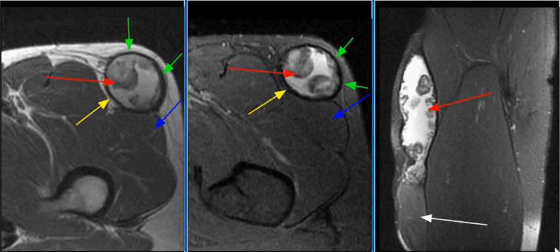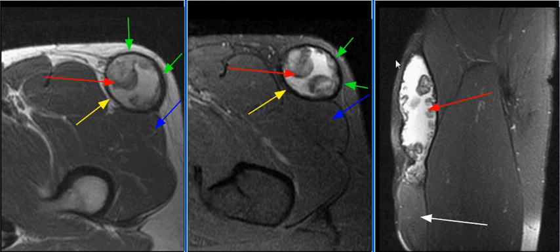A 25-year-old male with a history of trauma complained of a palpable lump and thigh pain. MRI examination shows a large fluid collection of heterogeneous signaling intensity dissecting along the subcutaneous fascial planes of the anterolateral thigh, superficial and anterior to the tensor fasciae latae.